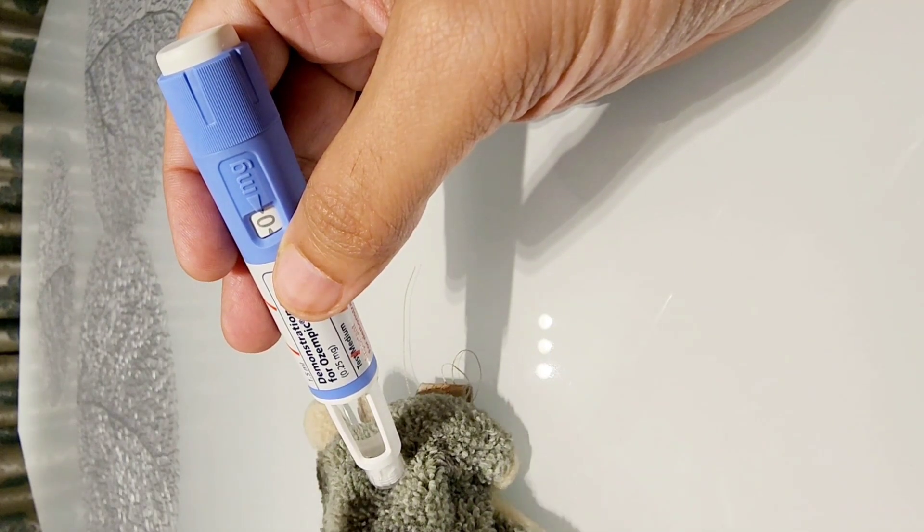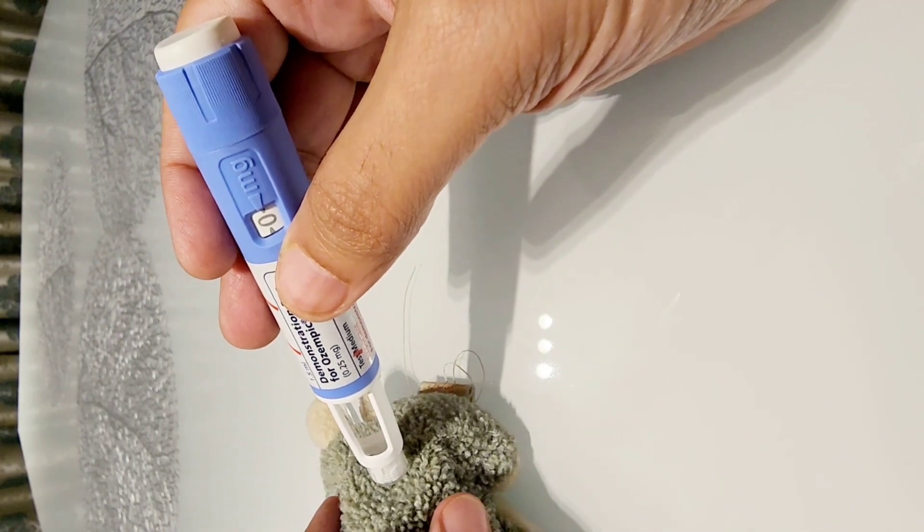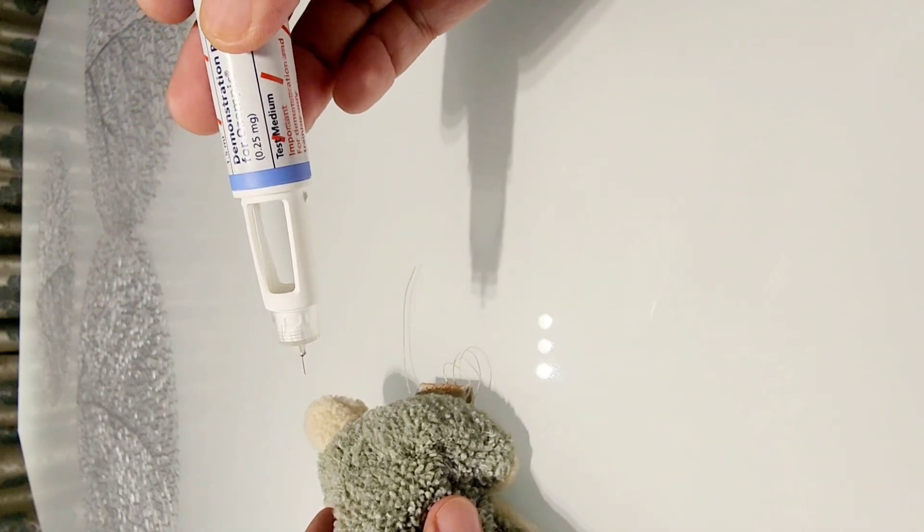Just briefly like 1, 2, 3, 4, 5, 6, 7, 8, 9, 10 to make sure that the last drop has been administered.